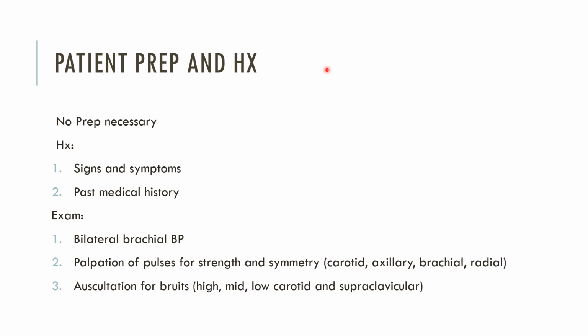Now, the patient prep and history. The patient prep for a carotid exam is really pretty simple. Your patient doesn't need to do any fasting or any specific prep. The history is a little bit more complicated, and then you're also going to do an exam.